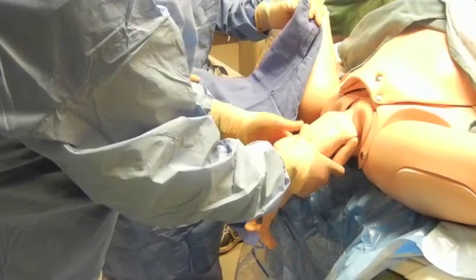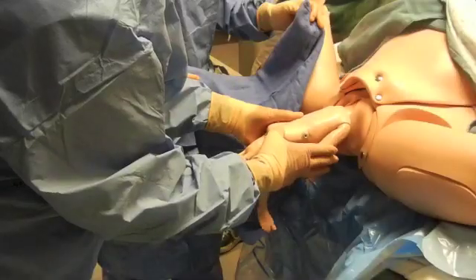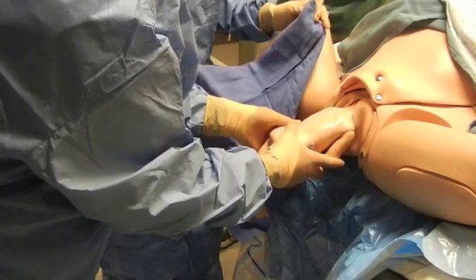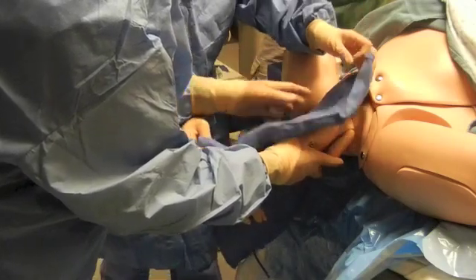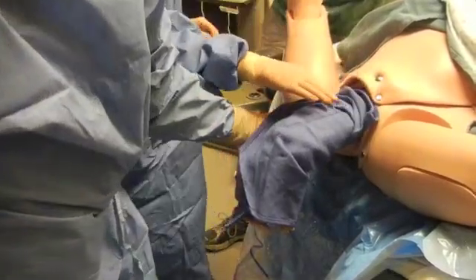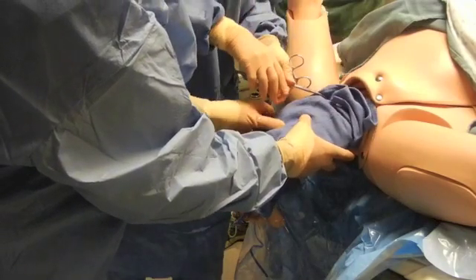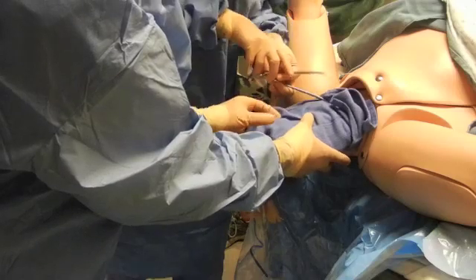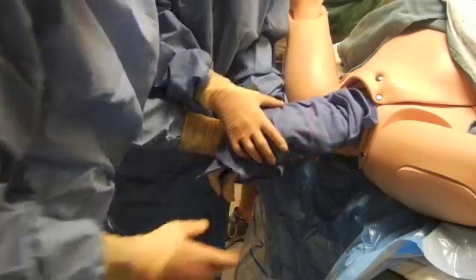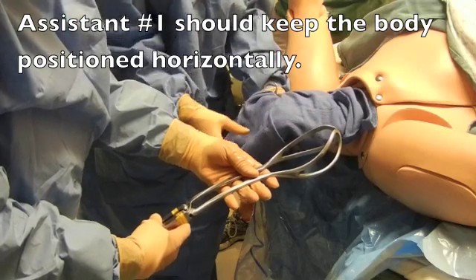The baby has been delivered such that the arms and legs are all out, but in order to apply the forceps, they're actually in the way. So it's preferred to wrap a towel around to hold the arms and legs. You can roll it like a package at the top and put some clamps on to hold it in place.